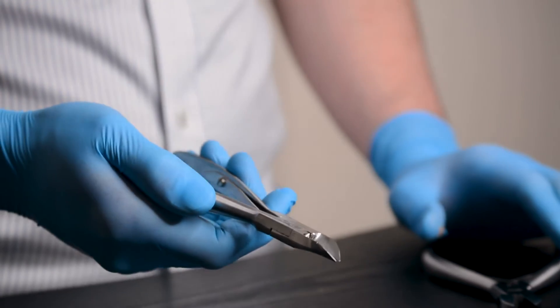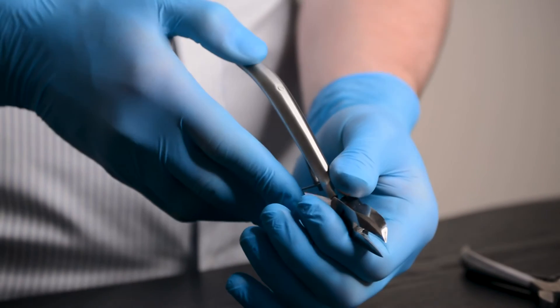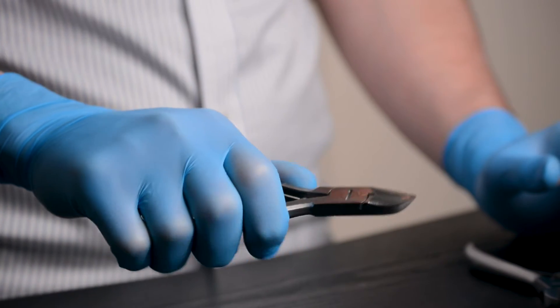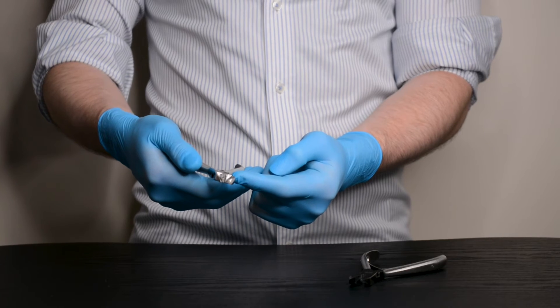The Bailey general-purpose nipper is manufactured from a high-grade medical steel, ensuring durability and longevity. This is one of our most popular general-purpose nippers, which is available with either a curved or straight cutting edge depending on preference.